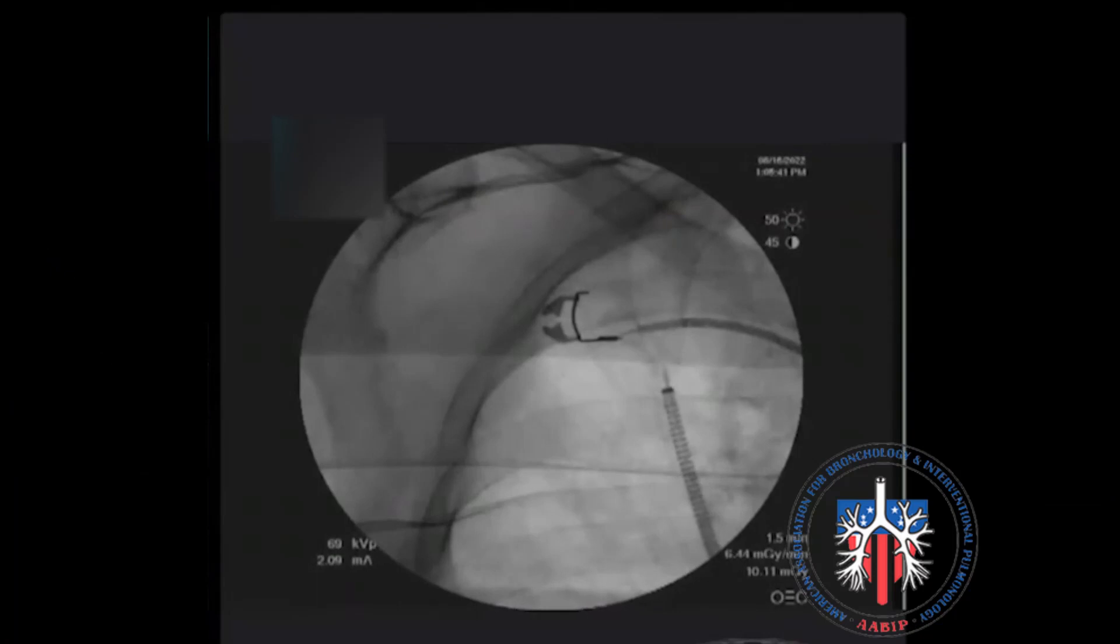The cryoprobe achieves a circumferential freezing around the tip. The average freezing time is between 3 to 6 seconds.